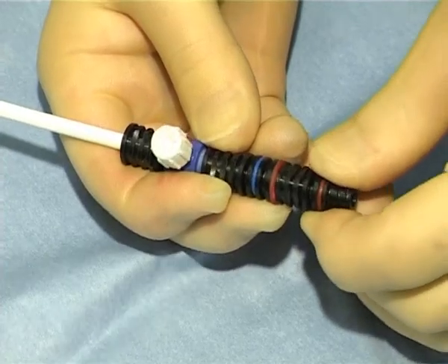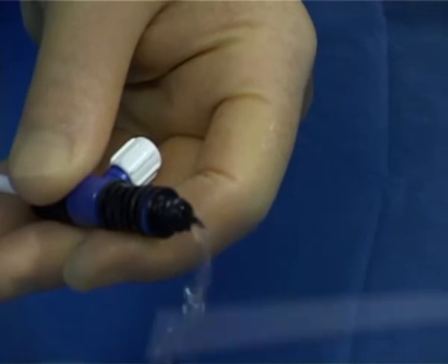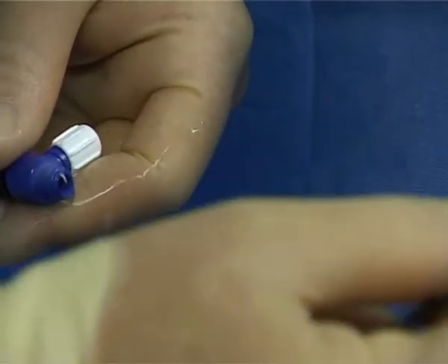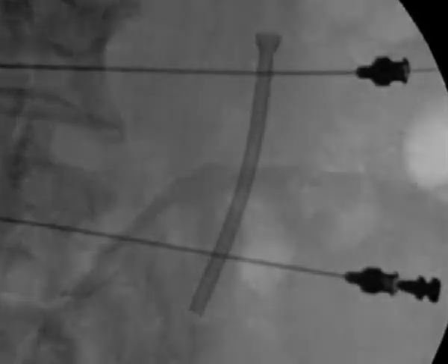The most distal connector between the red and the blue ring is separated, and the white inner tubing pulled out of the stent, which is thus detached from the insertion system. The final stent position is recorded with a plain X-ray.